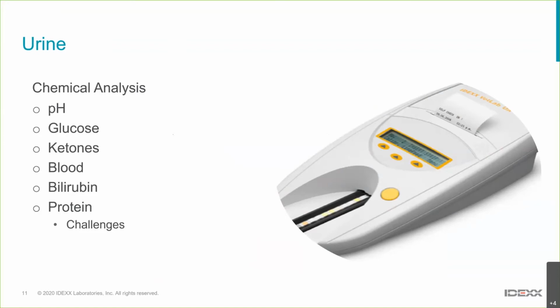The blood strip can be the result of intact cells or pigment. So looking at a sediment can give us an answer with that. Or even simple things like if you've got red or discolored urine, spinning it down. If the supernatant clears with spinning it, it was intact cells.